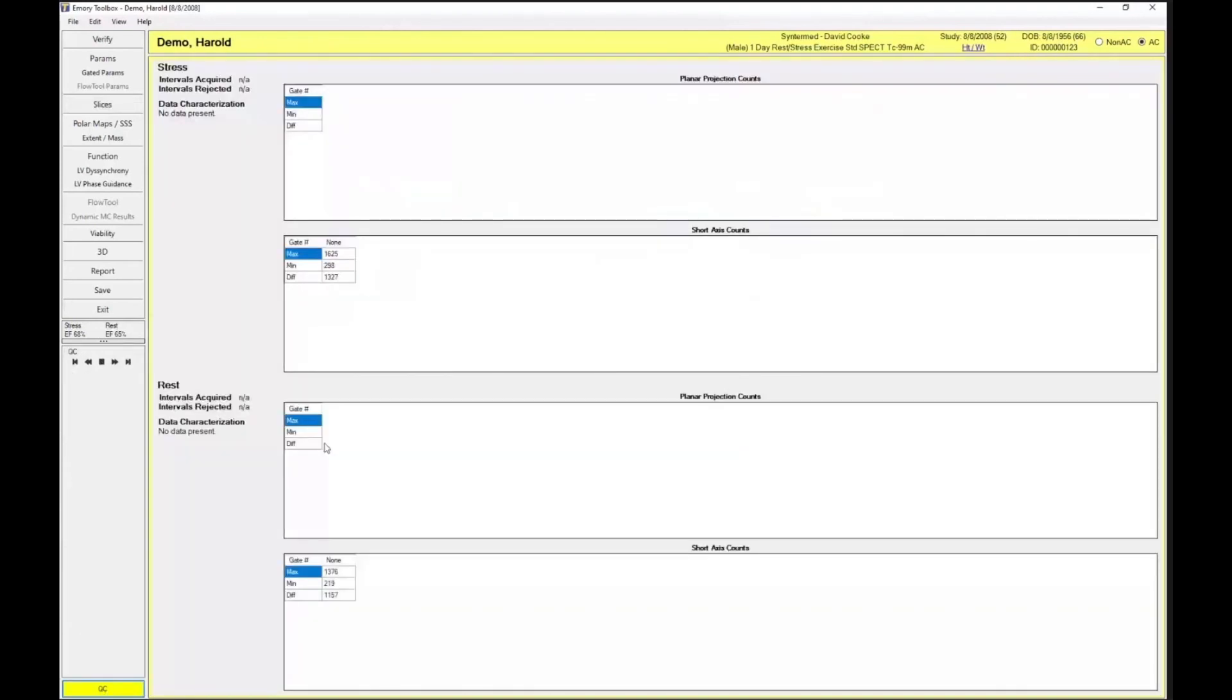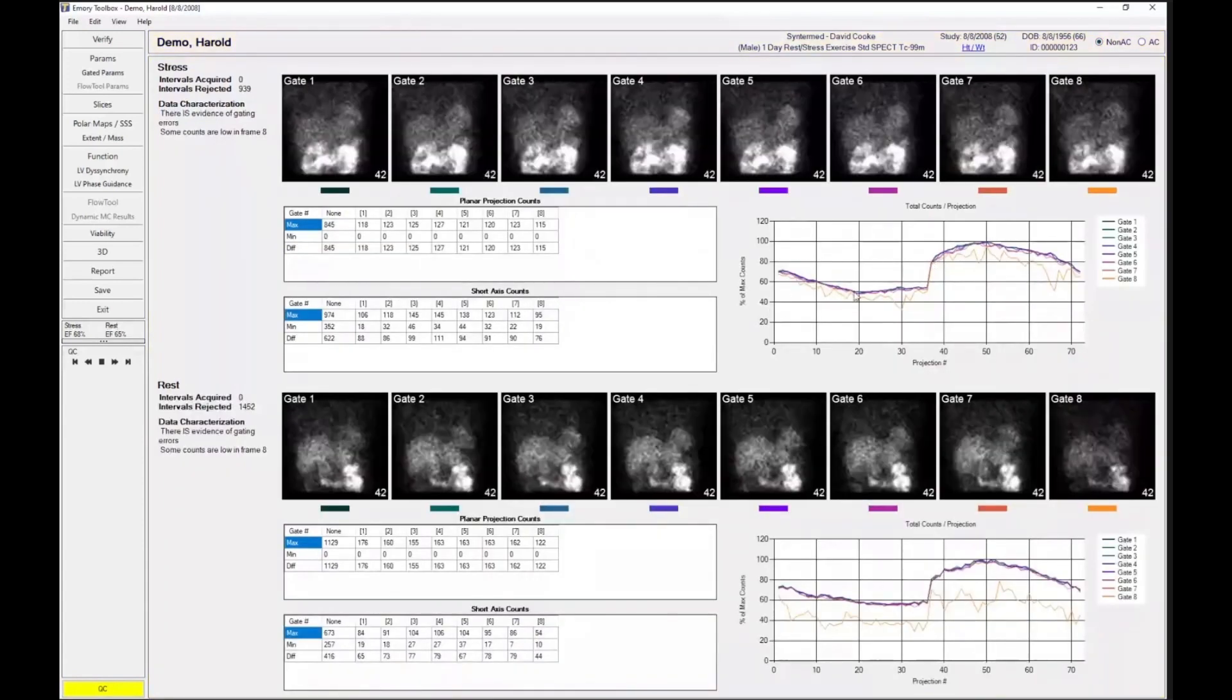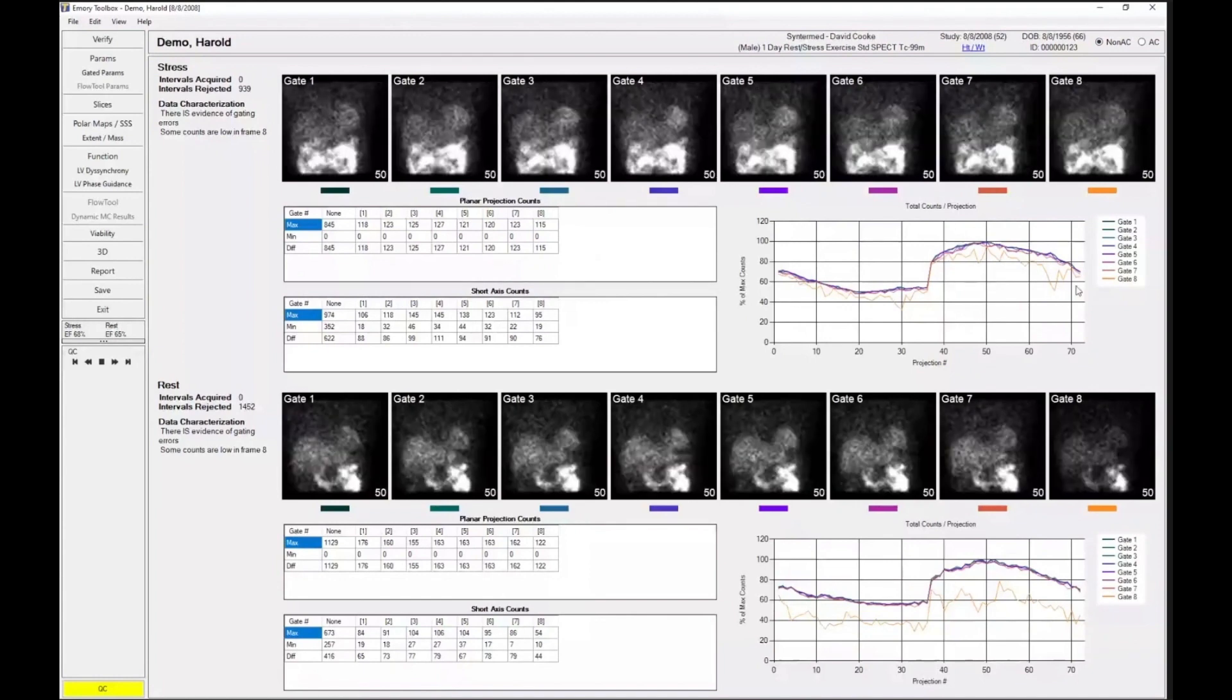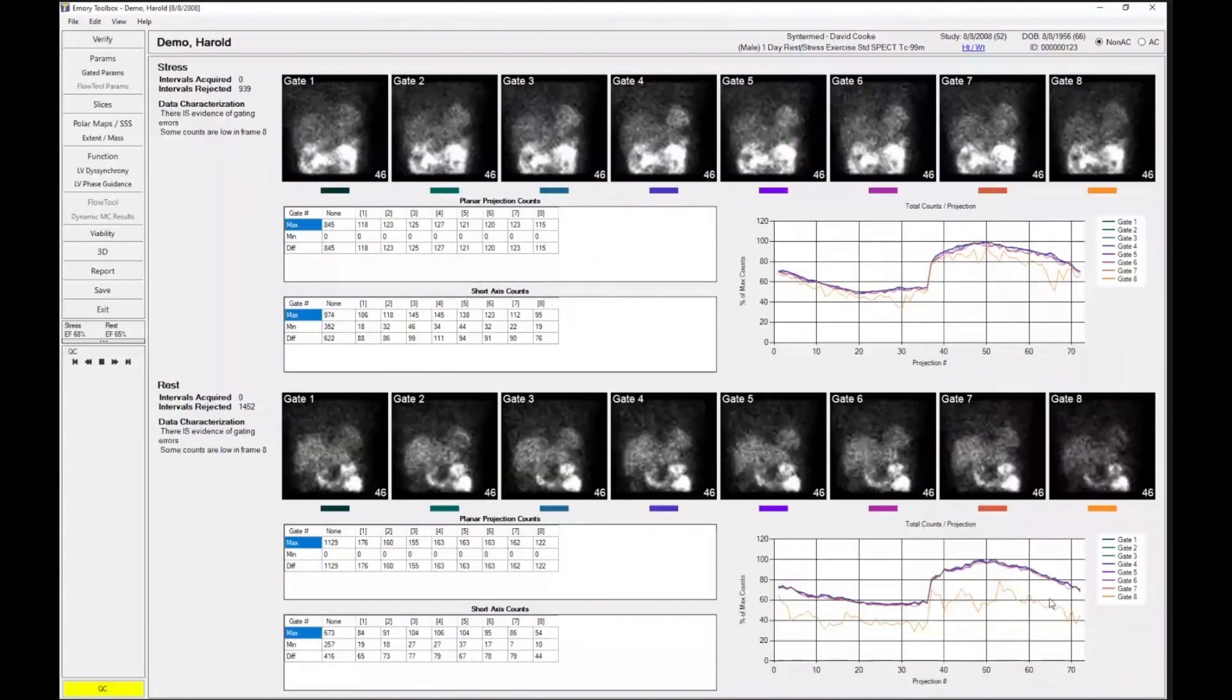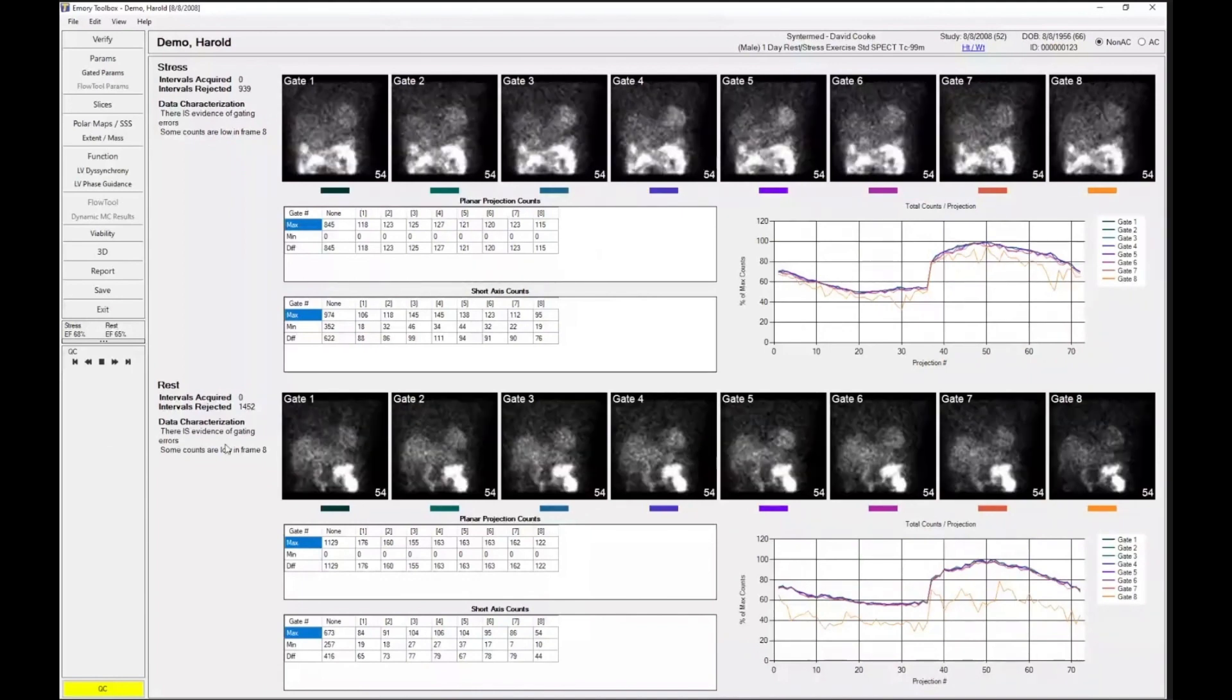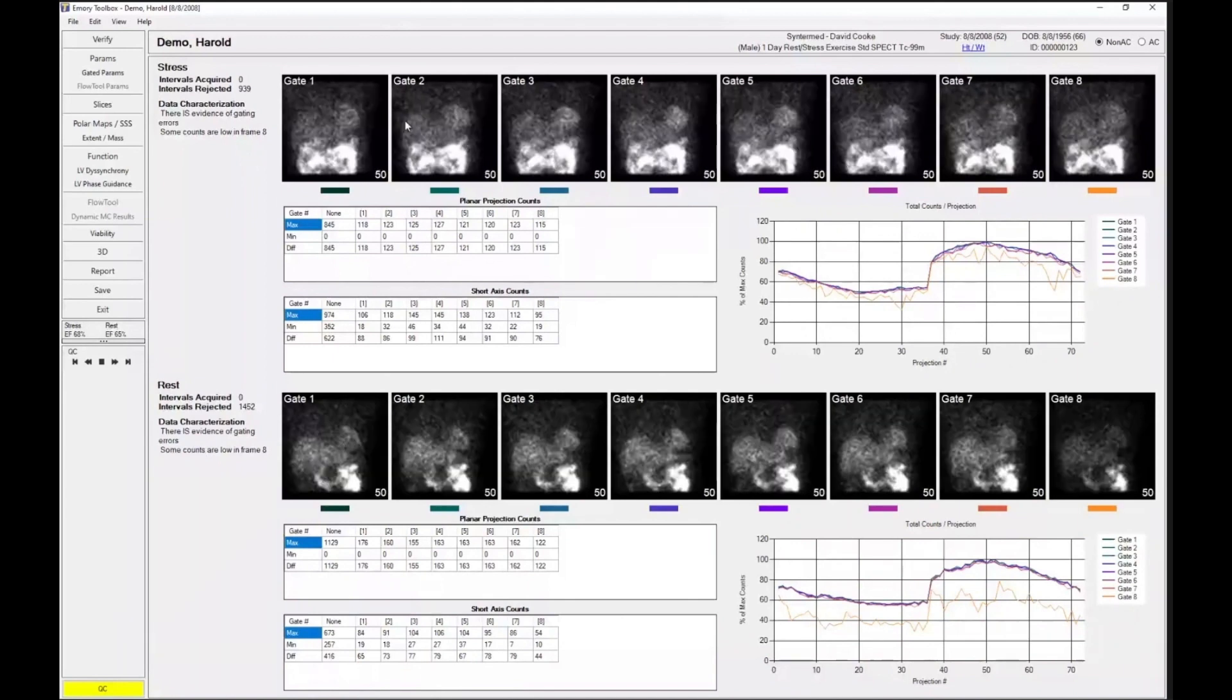If I click on that button, it will take us to the page. And it's telling us that there are some slight issues in frame 8. You can see that there were some count dropouts at stress, even more count dropouts at rest. And it's just identifying that there are some evidence of gating errors because there are low counts in frame 8.